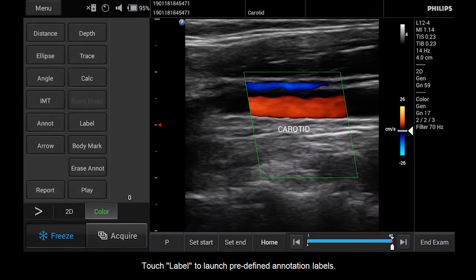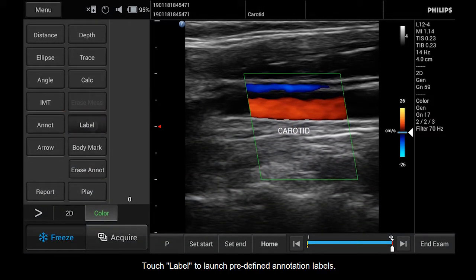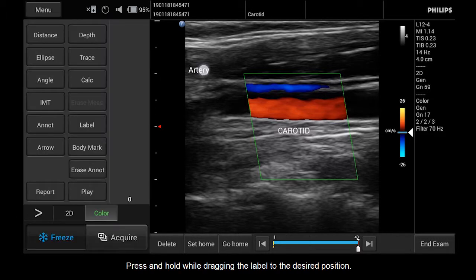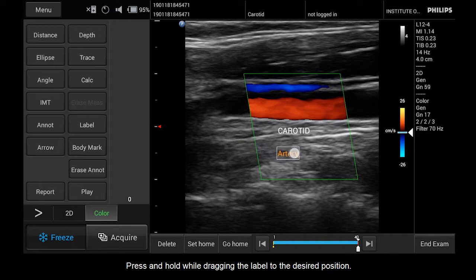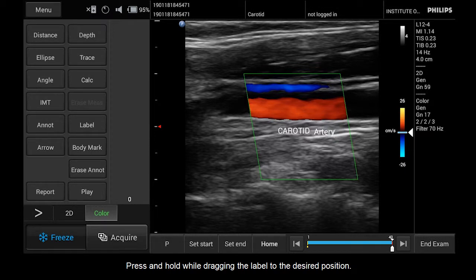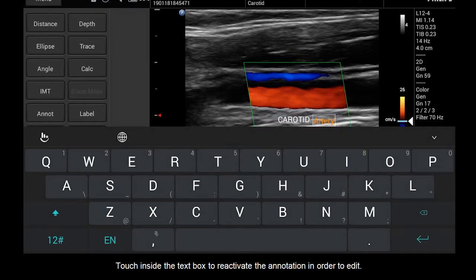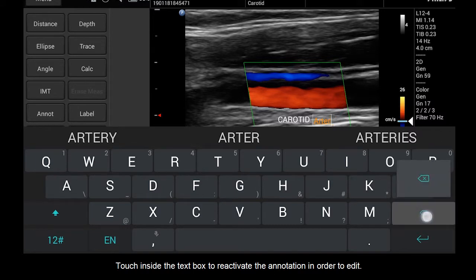Touch Label to launch predefined annotation labels. Press and hold while dragging the label to the desired position. Touch inside the text box to reactivate the annotation in order to edit.